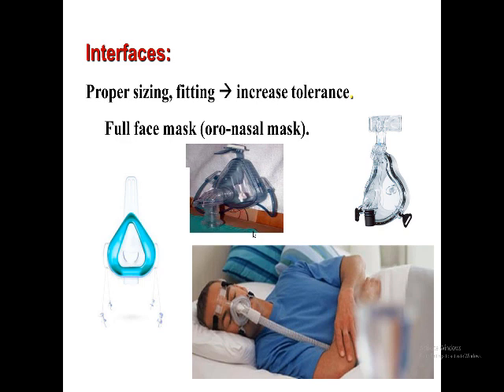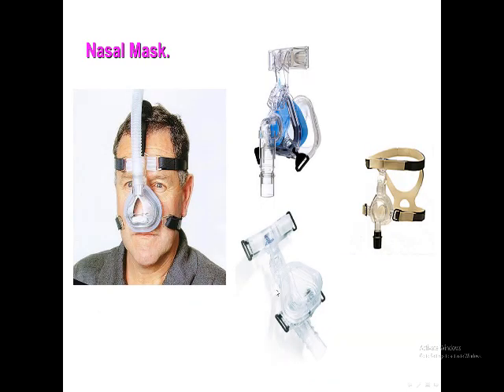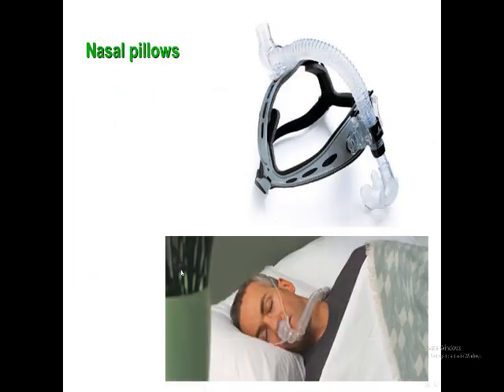These are the types of interface. This is the oronasal mask, nasal mask. We have a mouth here that is open. We have nasal pillows.